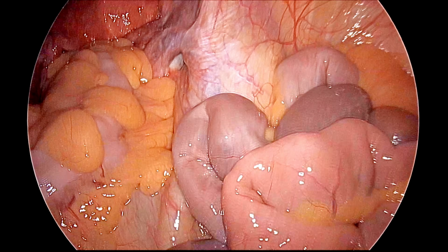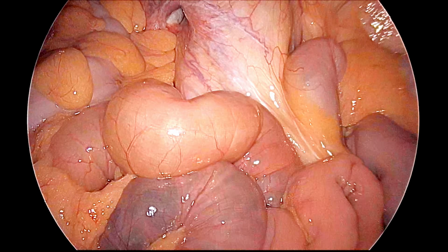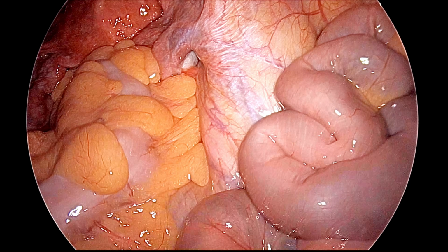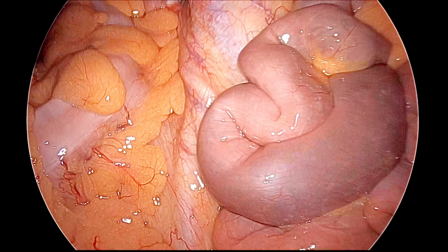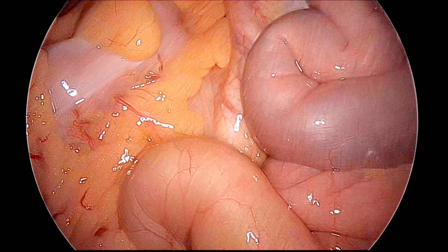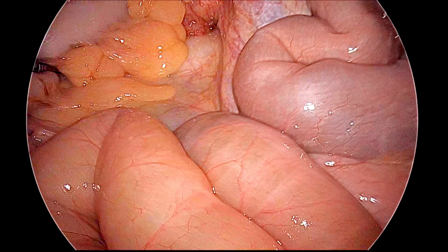So we can see it is near the aorta, and this is the aortoiliac axis, where the aorta bifurcates into the two common iliac vessels. Just below on the screen you can see the aorta, and the common iliac vessel of the right side is visible, and in the middle there is the aorta. So everything is fine, and there is no endometriosis, no inflammation, no tuberculosis.